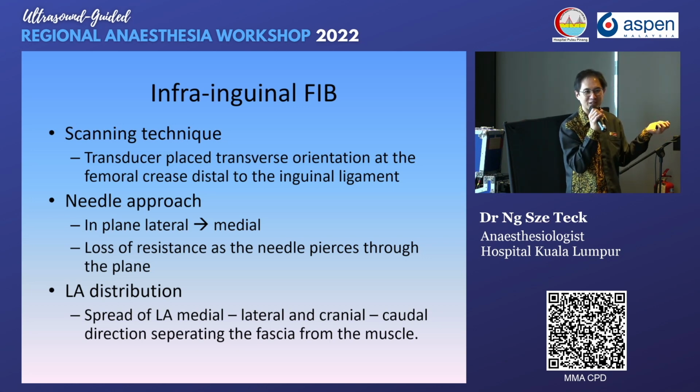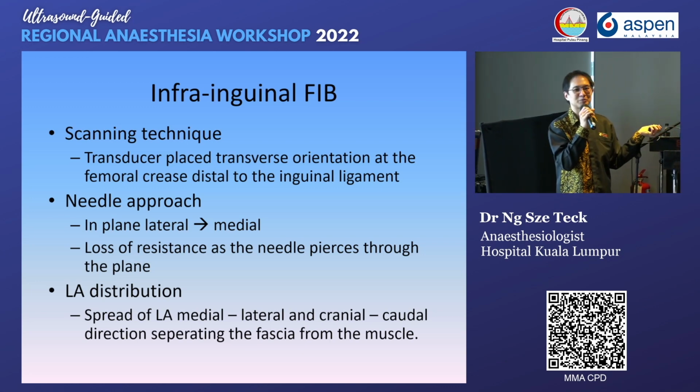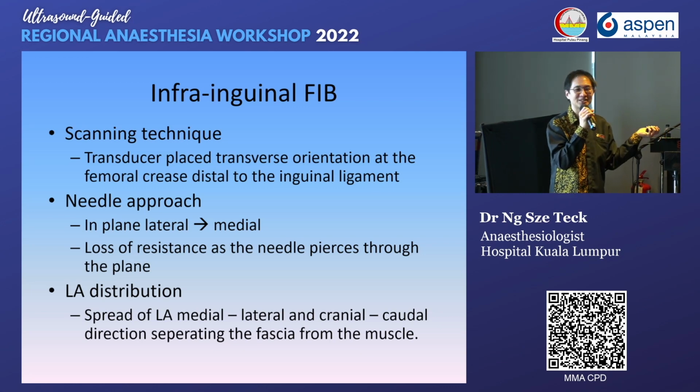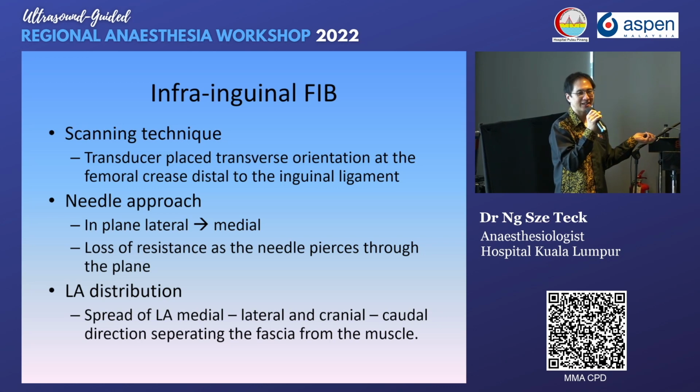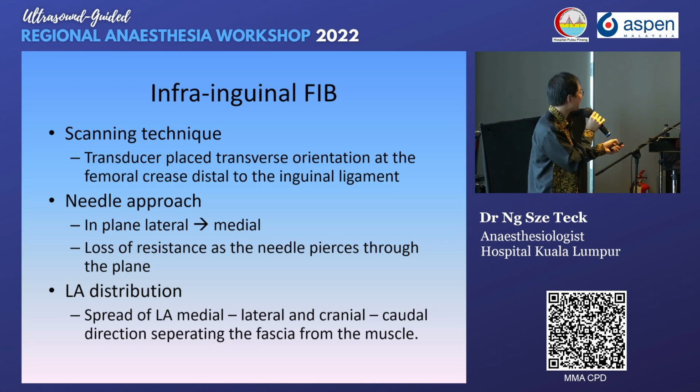This is the problem with fascial plane block. Another problem with fascial plane block: what is a good spread? And does good spread result in good analgesia? Yeah, you need a good spread, but at least you must see the spread. You must see the separation of the muscle and the fascia, not injecting into the muscle. Sometimes injecting into the muscle will not get a good effect.